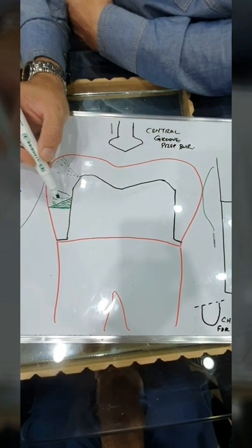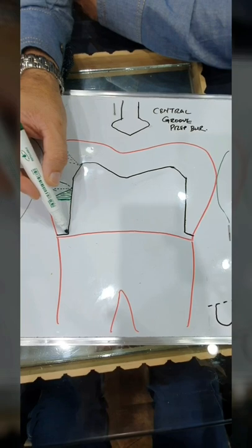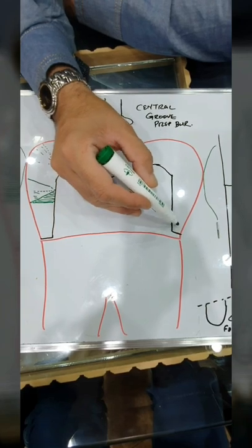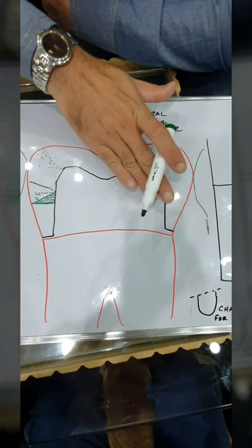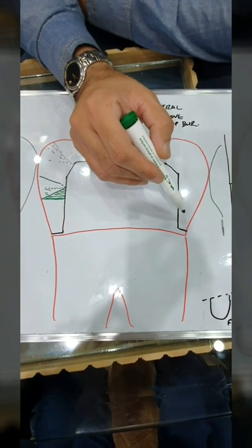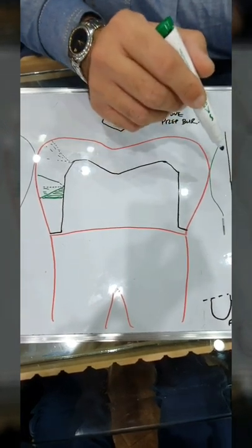Keeping that principle in mind, I like to make all my angles slightly obtuse, not at 90 degrees out, but sloping downwards. This also helps in cementation. When you're cementing the crown down, the crown does not have to sit exactly at the edge. It could slide in and give you a better seal at the tip if the emergence angle of the margin is obtuse. So obtuse is a better angle to have.